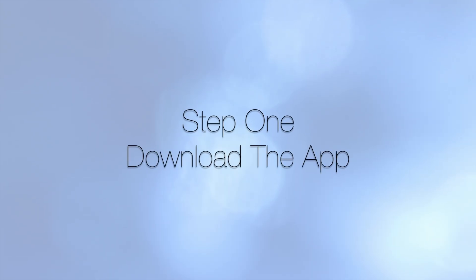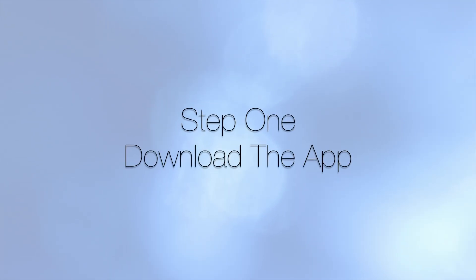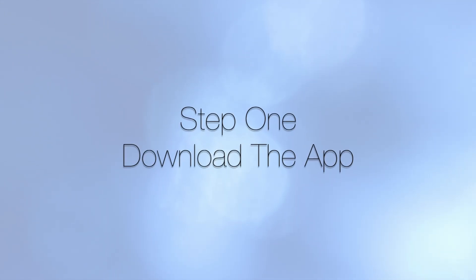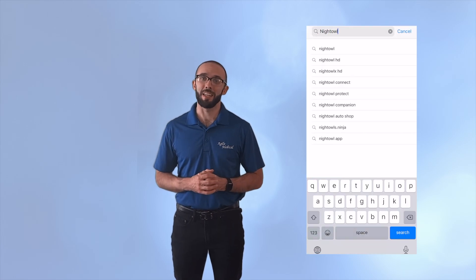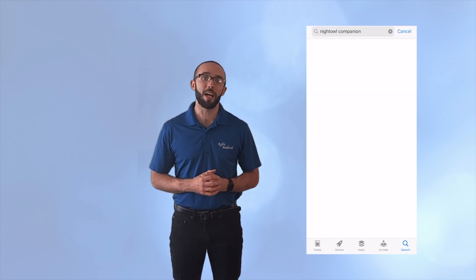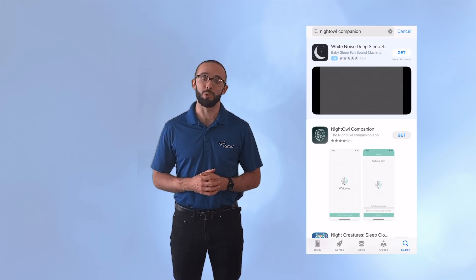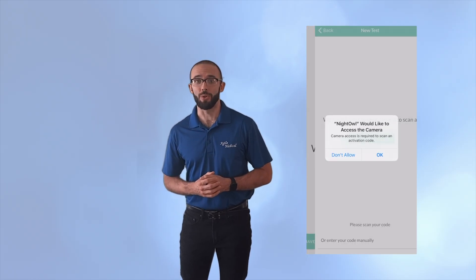Step one, download the app. You can download the Night Owl companion app from the Apple App Store or Google Play. Once installed, open the app and click I have an activation code.